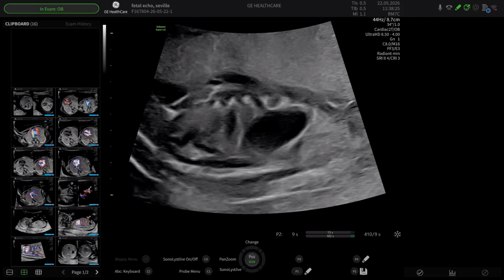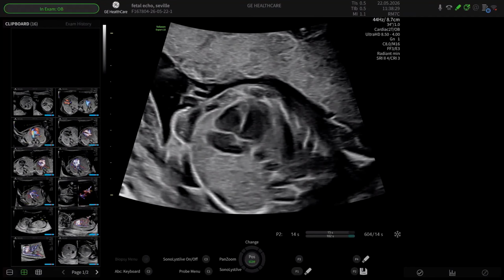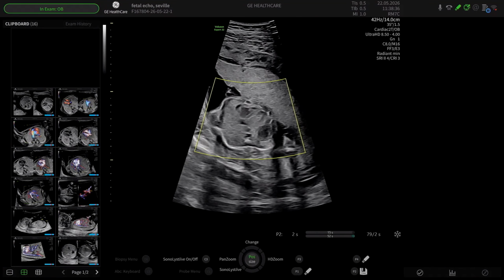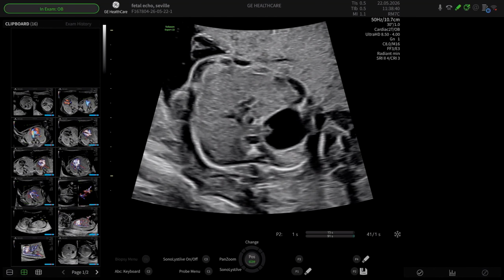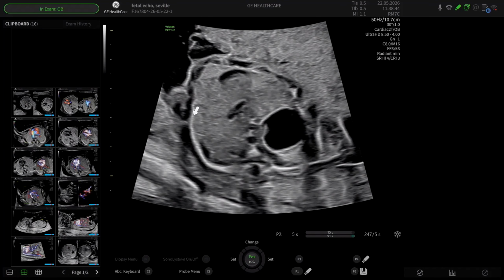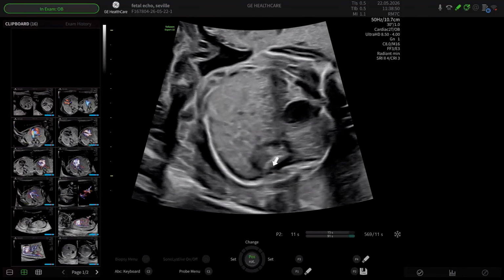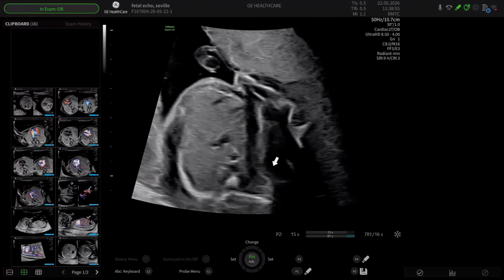So I think the best way to do it, practically speaking, if I ever want to see the ductal and aortic arches, and I actually haven't spoken about those, it's sort of a golden rule really. I start off by showing a picture of the stomach, and I get the rib on this side and the rib on both sides, so I don't end up with an oblique section to the ribs. I get a perfect section showing clean ribs and stomach in view.